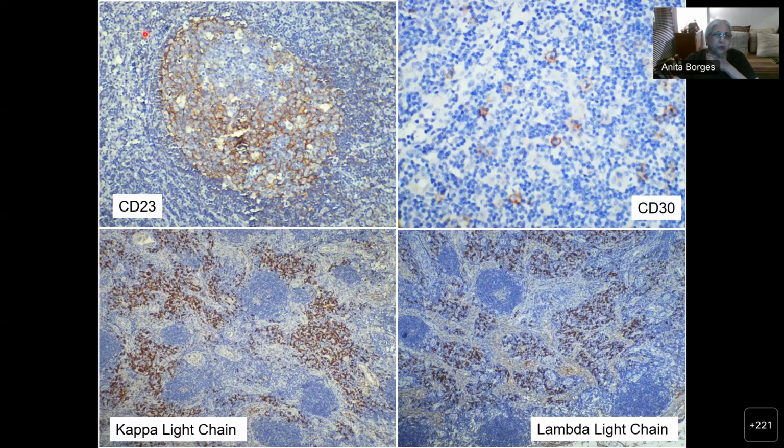Sometimes you're lucky, and you will see that the mantle also takes up CD23. That's just a normal pattern of reaction, but you should know that and not get confused.